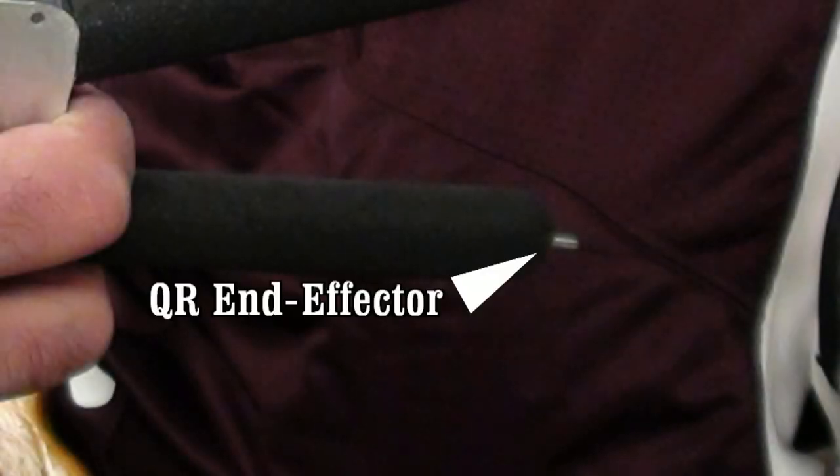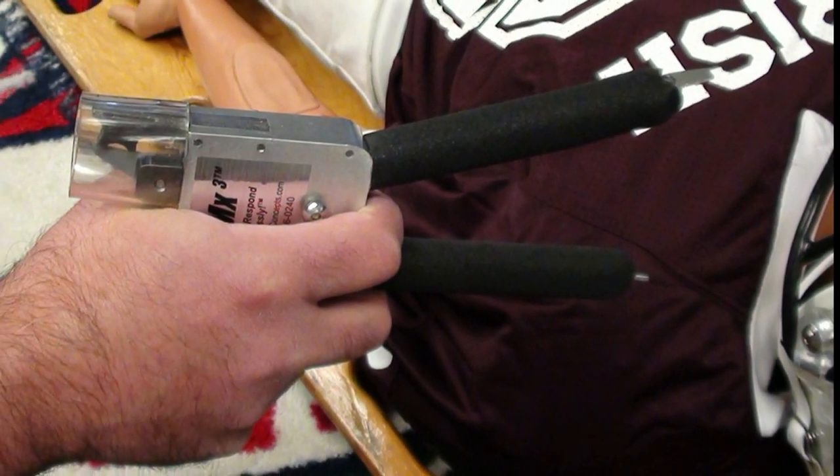The FM Extractor handles contain an end effector specifically designed to activate the Riddell quick-release hardware. To use the FM Extractor quick-release end effector, leave the blade safety protector in place while using the pistol grip hand position.